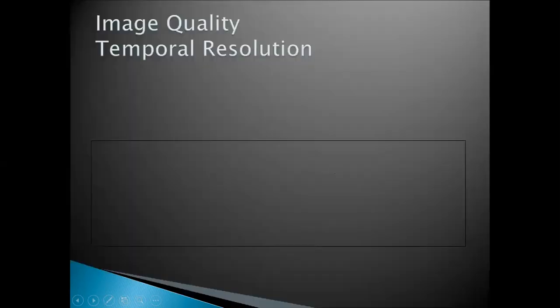So we now also look at temporal resolution. Fluoroscopy, we know, has very wonderful temporal resolution. Temporal resolution is the resolution due to time.